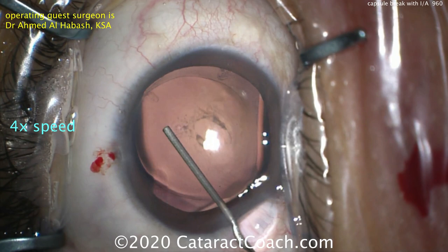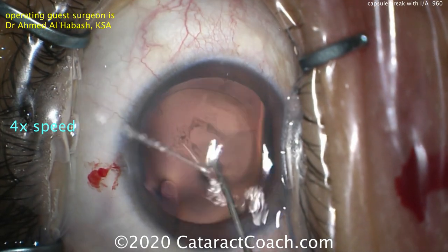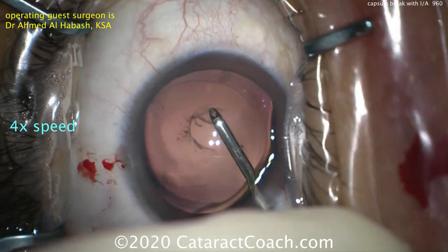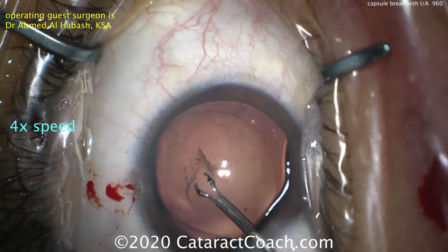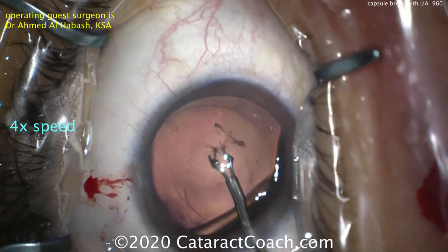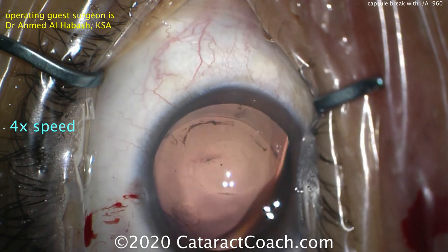Extra viscoelastic is always helpful. Using micro capsulorexis forceps, he's going to grab that tissue and create a nice round capsulorexis. The round capsulorexis is very helpful because it has no weak edges — it's a round circle and it won't run out. He makes a little nick with a needle to get it started, then grabs with the forceps. Notice how much extra viscoelastic is being used — remember the saying: viscoelastic is cheaper than vitreous. He takes his time and finishes it — a very strong posterior capsulorexis with very low risk of running out.